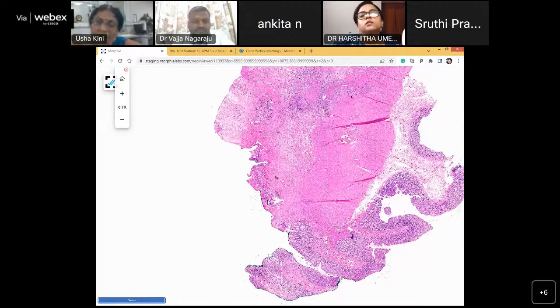So maybe I could have told you here, this child had a perforation when the child was 7 years old.